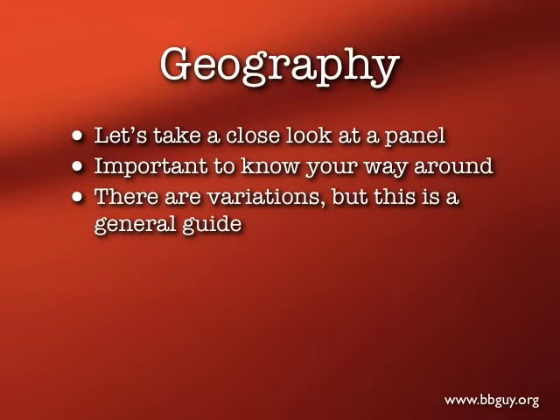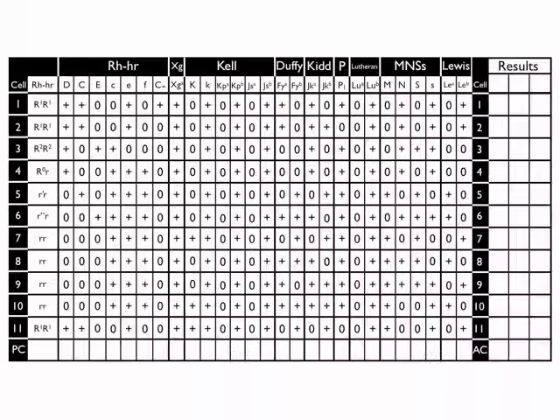So let's take a real close look at a panel. It's really important that you know your way around one of these things, and you get less intimidated the more you understand the roadmap. There are some variations, and what I will show you is just a generic panel. It's not associated with any particular company, but this panel will give you a basic idea so that you can handle basically any company's panel that you see. So here's how it is. Ta-da! Here's an antibody panel.